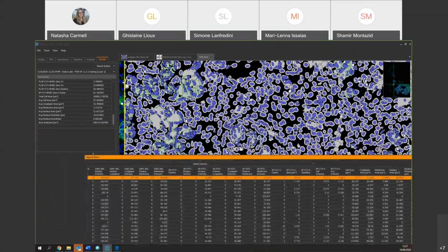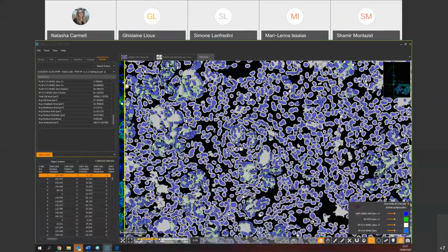All right, so I think I've covered everything for this algorithm. Do you have any questions? Yes. If I have a Z stack, while analyzing, shall I take a maximum intensity projection and then do the analysis? Yes, this is what we would recommend.